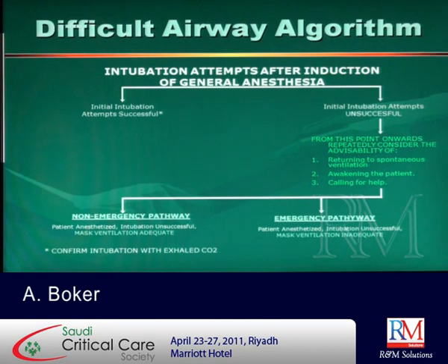So when do we get into these difficult airway cases in anesthesia? We could be there unexpectedly. We did not know it was difficult. We just gave the muscle relaxant and then it turned out to be difficult. Sometimes even with a good assessment, you might be rushed, your assistant inexperienced, or you just have bad luck. It happens; it could happen to anyone. So with an unanticipated difficult airway, you can't say you could have prevented it.